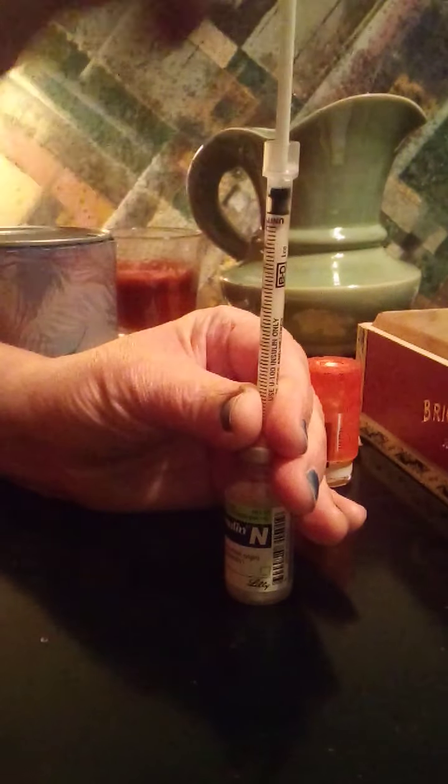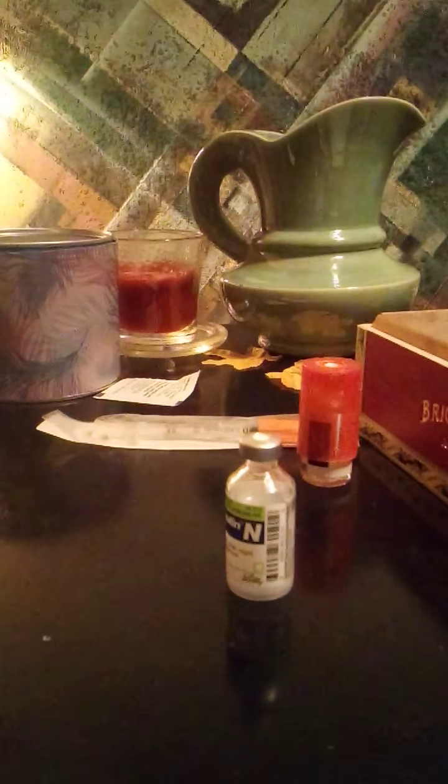Oops. It's amazing I didn't spill any. Okay, I'm going to plunge back in. Actually, there's an air bubble at the very end. You don't want an air bubble at the beginning. There's an air bubble at the end.